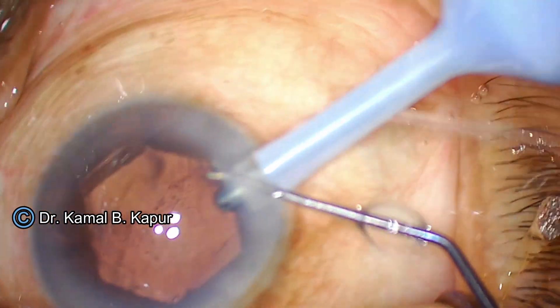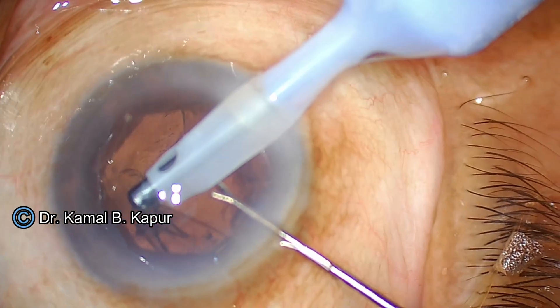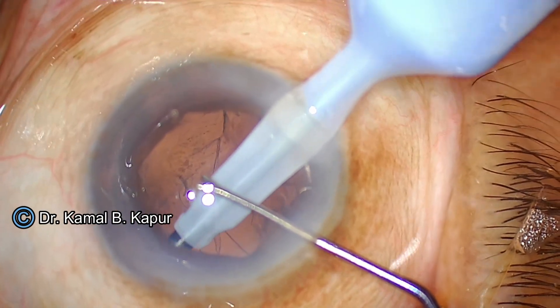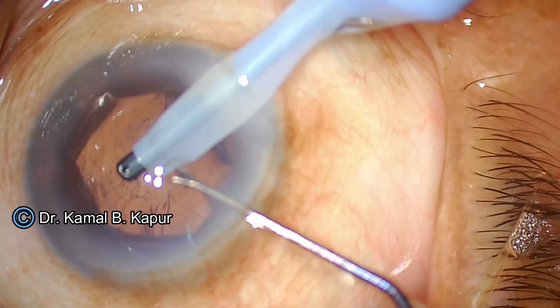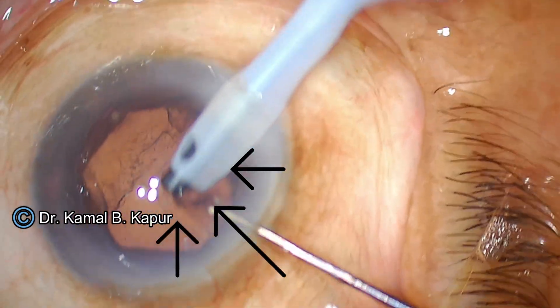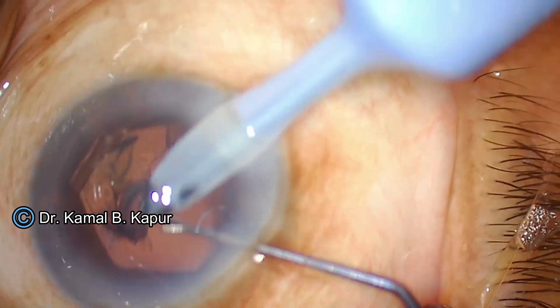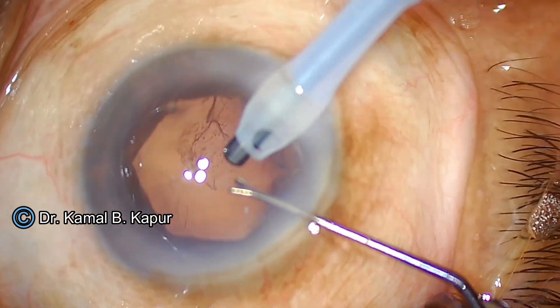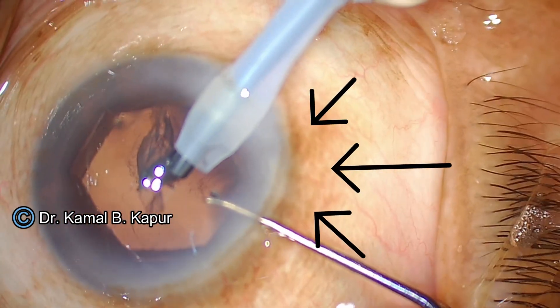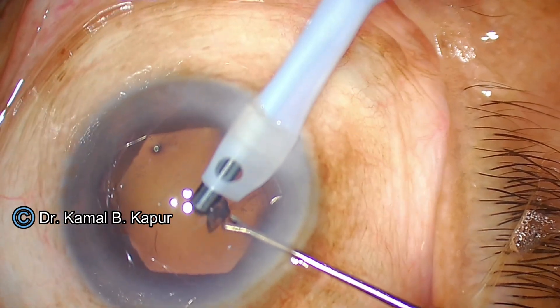Now we proceed to remove the cortex. When you have a weak zonular bag, do not try and pull the cortex radially towards the center. It is always a good idea to do side-to-side movements so that pulling forces are not directed towards one segment of the zonules. You will notice I do peeling movements to distribute the pulling force evenly across at least one quarter of the capsular bag segment. I do tweezing and separating movements rather than pulling directly radially, because with weak zonules the bag may be pulled along with the cortex.